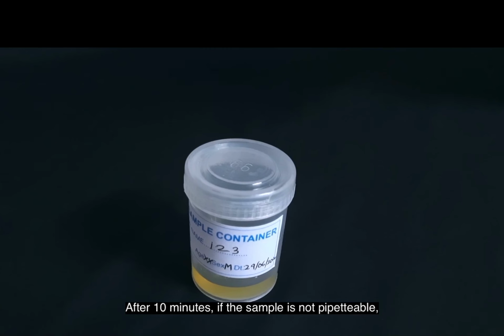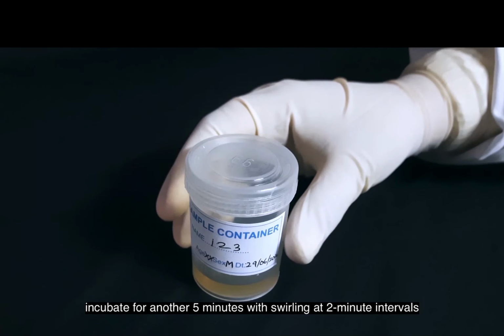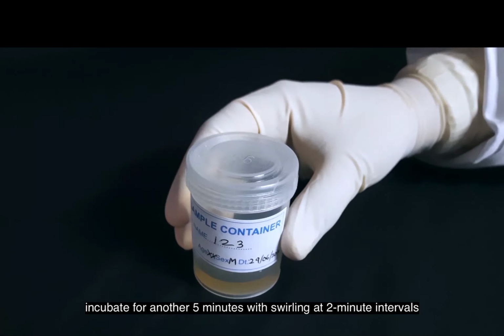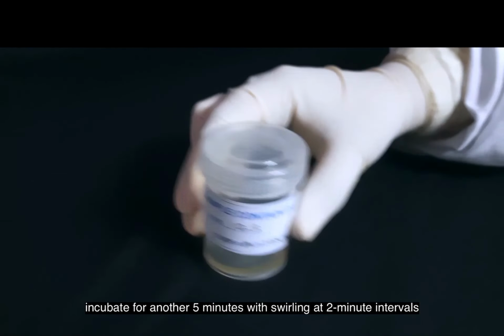At the end of 10 minutes, if the sample is not pipettable, that means it is still thick. Then what do you do? You incubate it further. You have to incubate it a little longer. You should not add more drops of liquefaction buffer, because if you add more drops, then you lose the number of tests you can do for that kit. So incubate it for another 5 minutes, and at every 2-minute interval, shake it slightly.